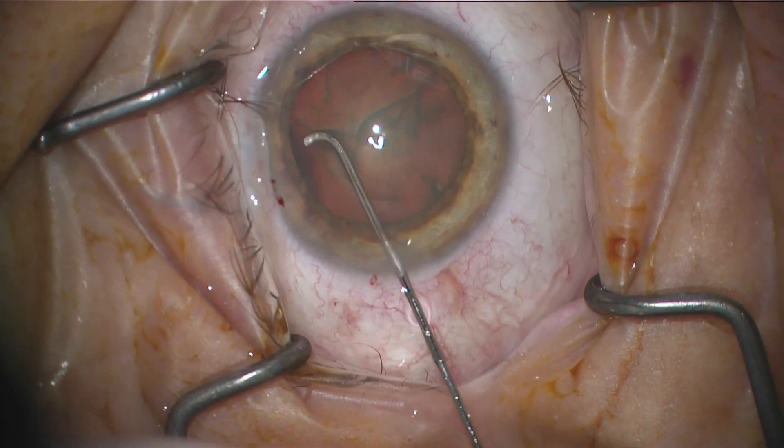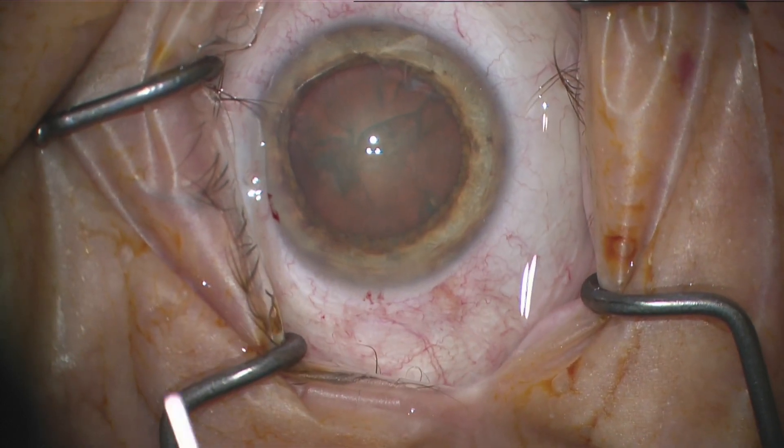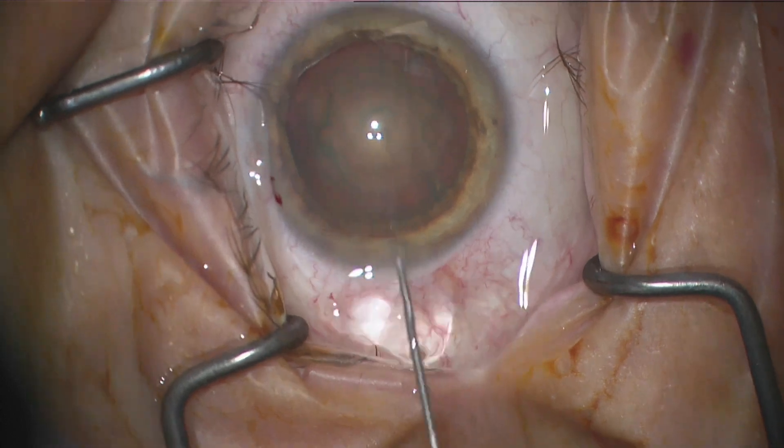The mechanics of it are sort of proprietary so I don't know the exact details of how that works, but it breaks the lens up in there and has a very unique noise when it's removing the lens.